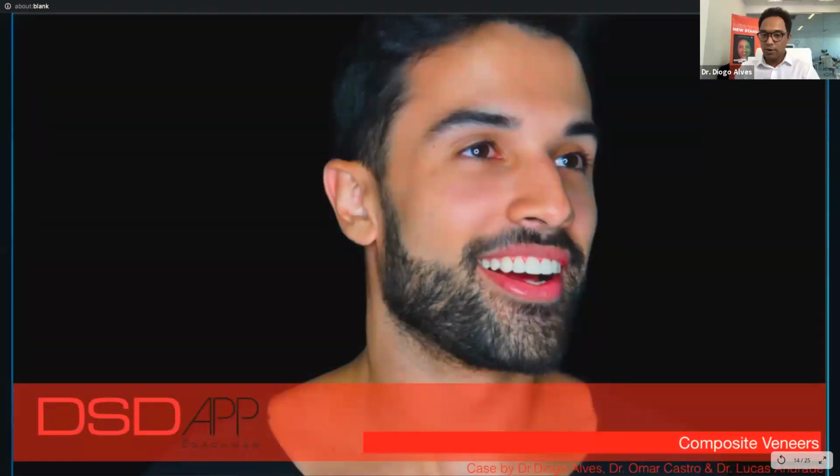This is the final result. In this case, I did 10 composite veneers. It was completely done with the DSD app. It took me about 2 hours to do 10 composite veneers. As you can see, it's very fast to do, given the amount of composite that we did there.